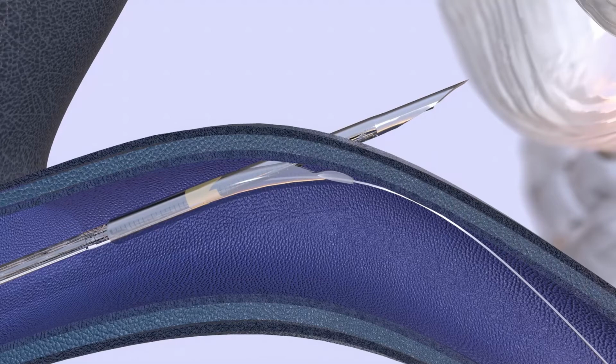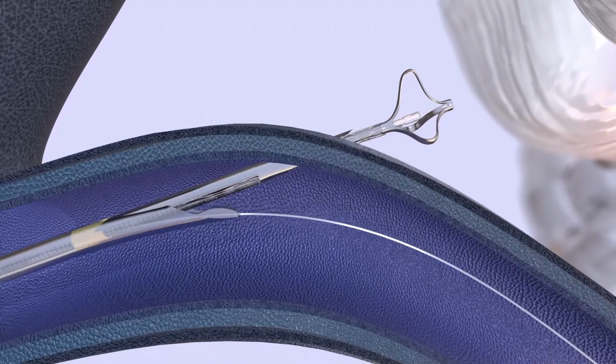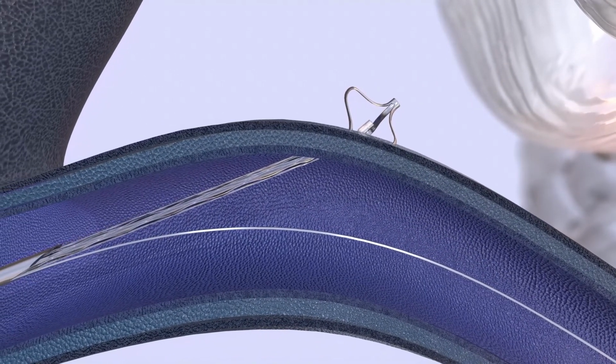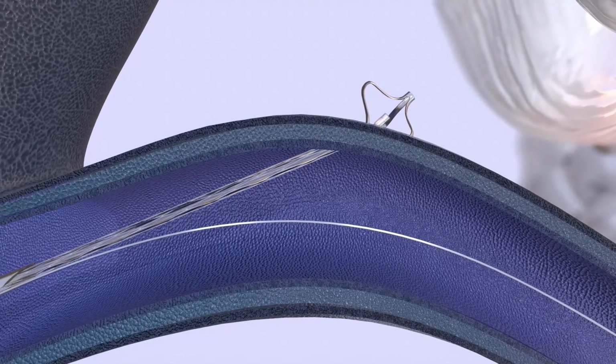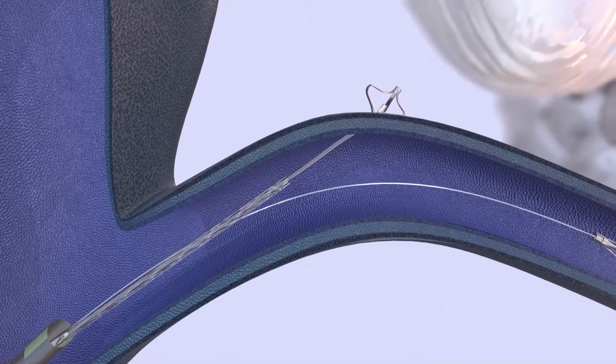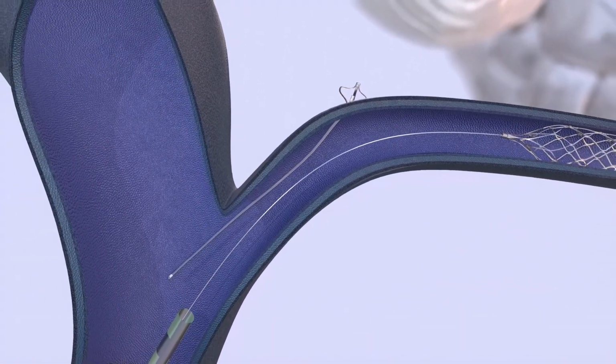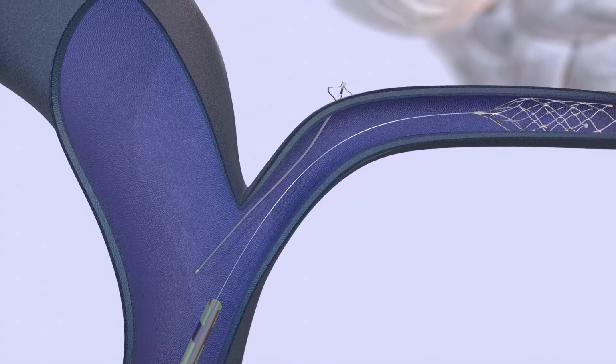CPA cistern. The operator deploys the implant malacot into the CPA cistern by advancing the shunt tether shroud distally until the malacot exits the delivery catheter needle. The delivery catheter is withdrawn to deploy the remainder of the implant into the IPS and IJV. The delivery catheter is then removed from the patient.